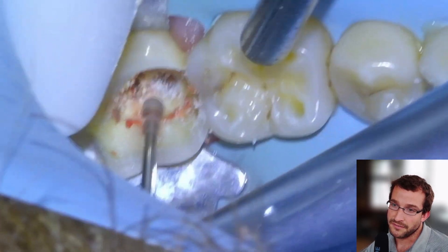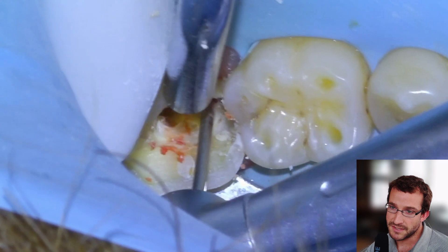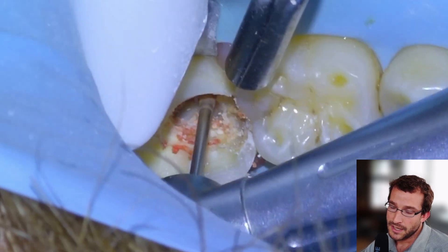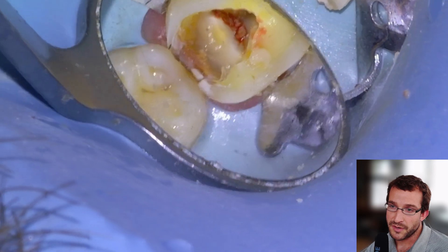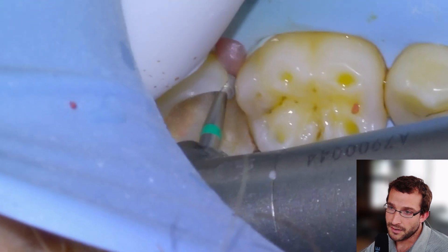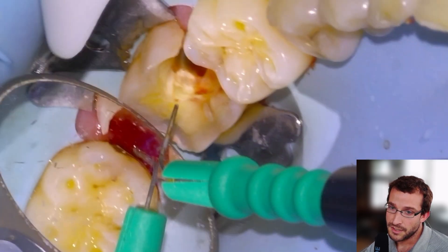We'll unroof the pulp chamber here with a Munce Discovery large Munce bur, and then remove the rest of the tooth decay interproximately, so that once we're finished the endo, all we have to do is whip up a quick crown prep. Lots of tooth decay left there that we're going to remove with our round burs, and we're going to make the gums bleed a bunch.